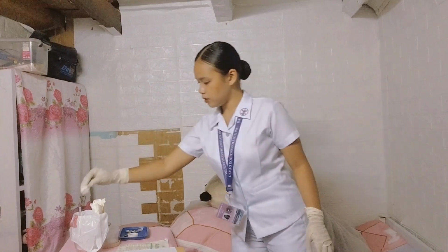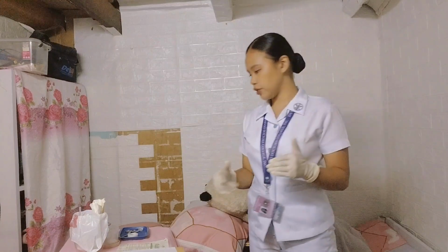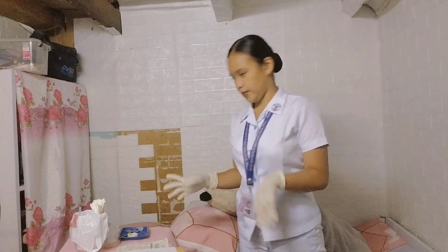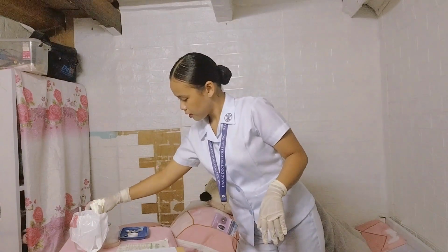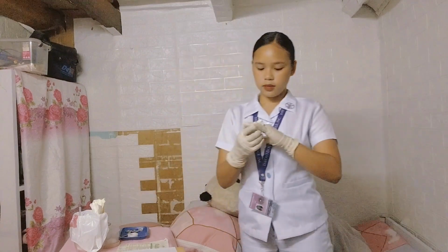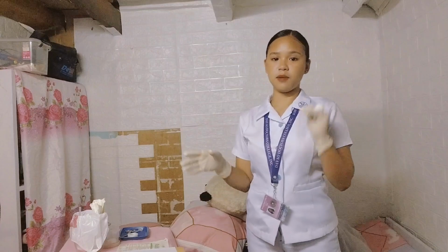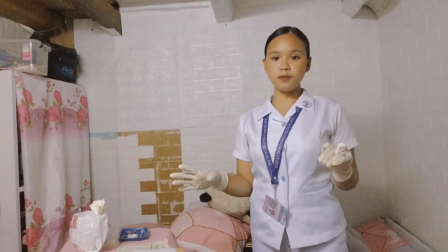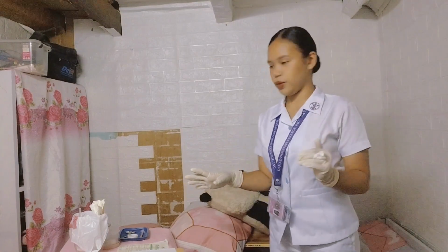And discard. Now let's prepare, or place and hold, the swab between the third and fourth fingers of the non-dominant hand, or position the swab on the client's skin above the intended site. Using this technique keeps the swab readily accessible when the needle is withdrawn.